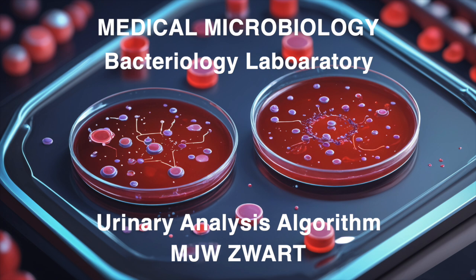So in those cases, what do they recommend? Back to the good old-fashioned techniques. Sometimes, yeah. They might suggest using alternative methods, like disk diffusion or E-tests, to confirm those tricky resistance patterns. It's a beautiful blend of cutting-edge technology and those traditional microbiology methods that have stood the test of time. It's like they're saying, use the amazing tools you have, but always be ready to roll up your sleeves and get back to the fundamentals if needed.